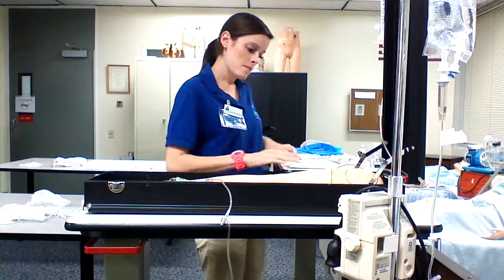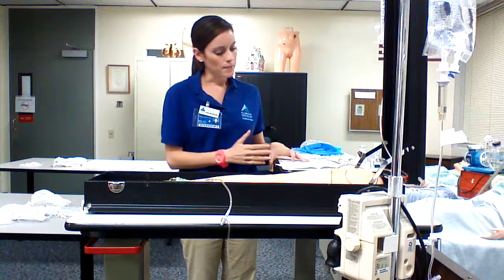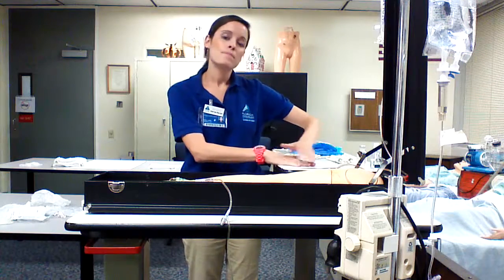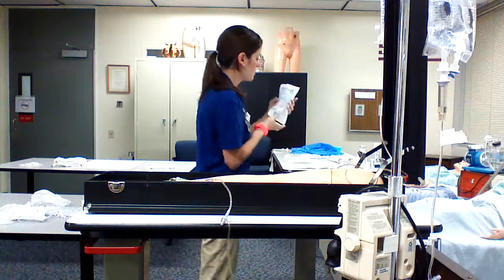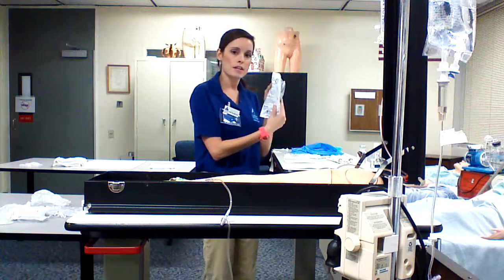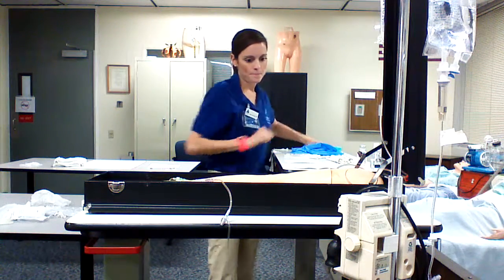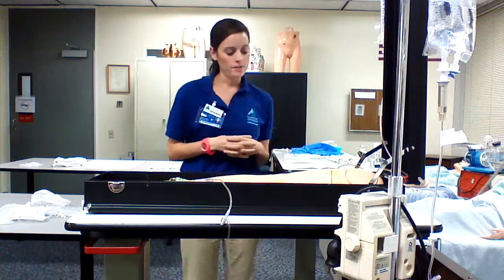So, per my doctor's orders, the physician has ordered 500 milligrams every 6 hours, and I've done my calculations. The vancomycin is available in 250 milligrams per milliliter, so I'm going to administer 2 milliliters of vancomycin today into the IV piggyback. I have my drop factor on my bag that's containing my tubing, so I know that that's going to be 10. And so through my dosage and my drip factor, I've calculated 14 drops per minute for the vancomycin today.